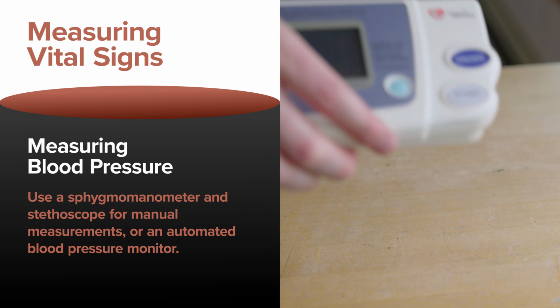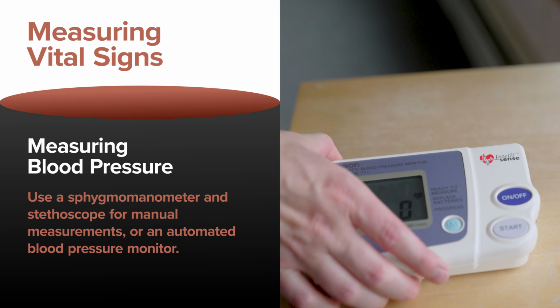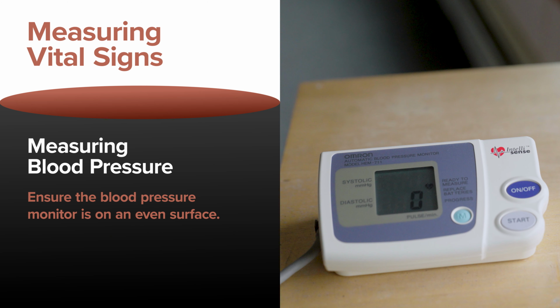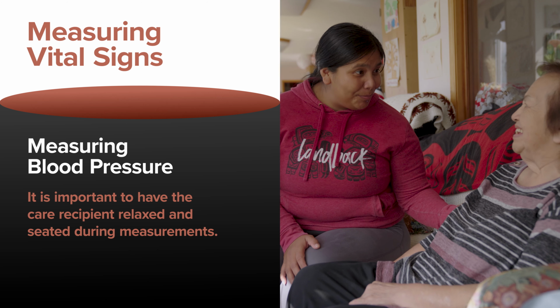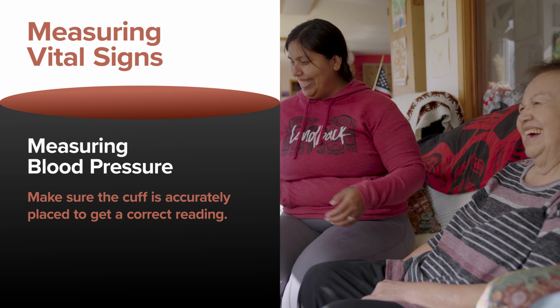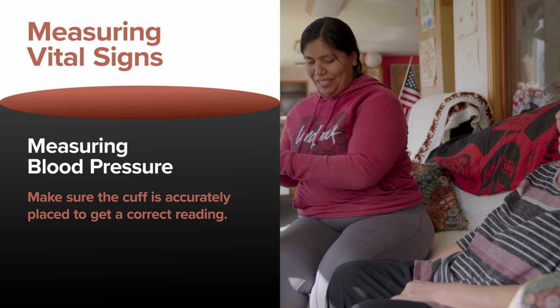Measuring blood pressure. Use a sphygmomanometer and stethoscope for manual measurements or an automated blood pressure monitor. Ensure the blood pressure monitor is on an even surface. It is important to have the care recipient relaxed and seated during measurements. Make sure the cuff is accurately placed to get a correct reading.